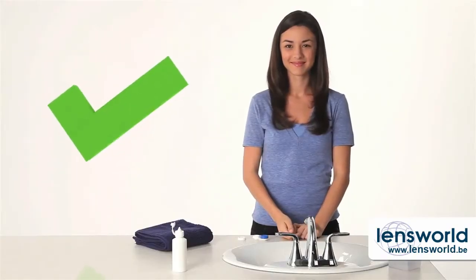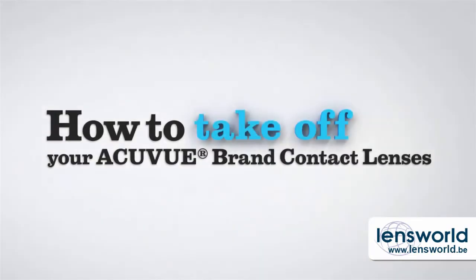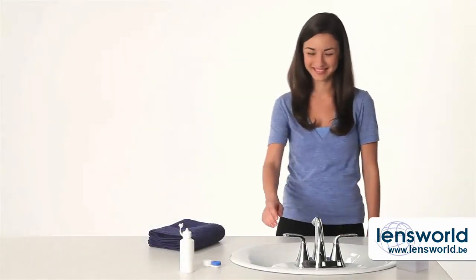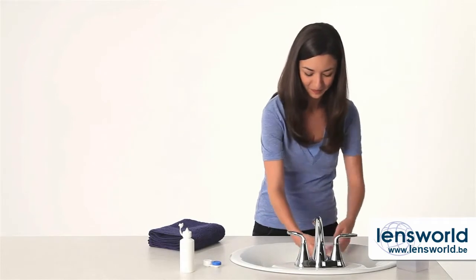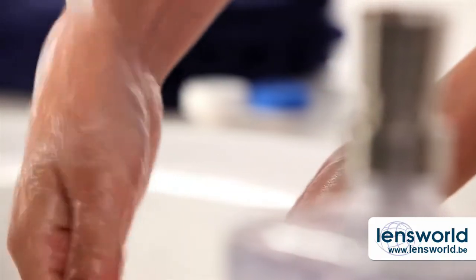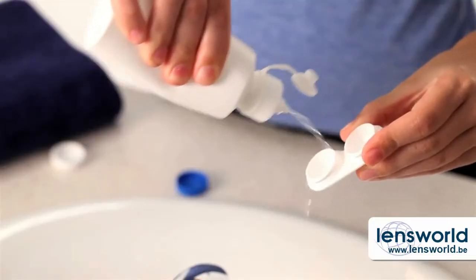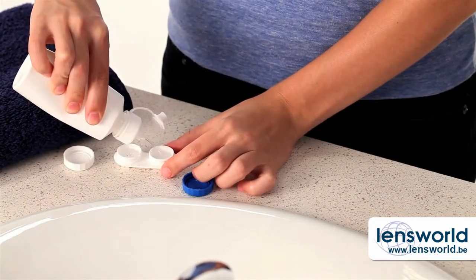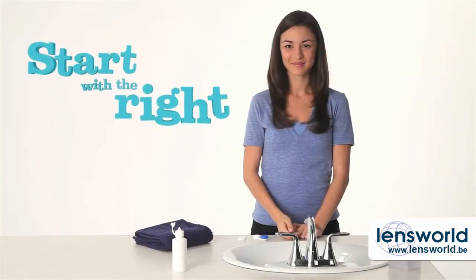Well done. You've had an action-packed day thanks to your new contact lenses, and now it's time to take them off. Most people think removing contacts is even easier than putting them on. What's the first thing? Right — wash and dry your hands, and prep your lens case with fresh solution. Just like when you put them on, start with your right lens.